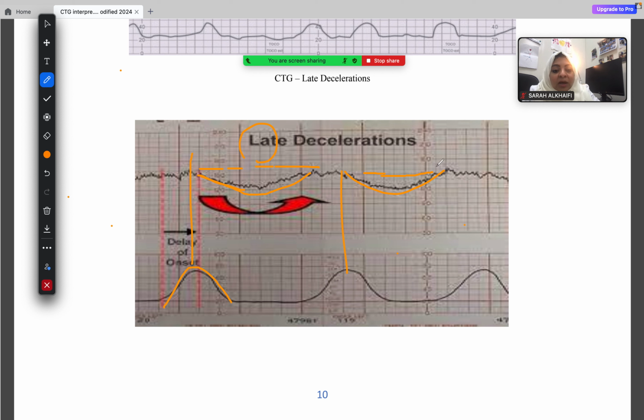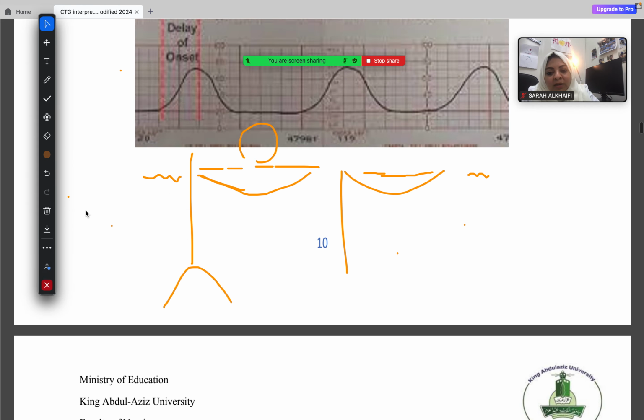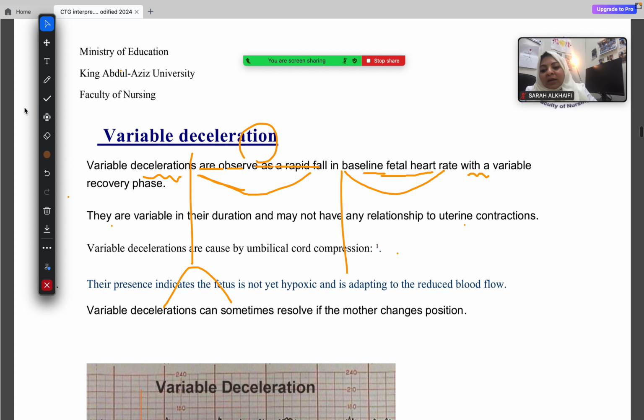And if you can see, the variability of the baby is within what is considered minimal variability, and we definitely don't like to see these changes in labor and delivery. We'll do our best to take care of the baby and the mother.